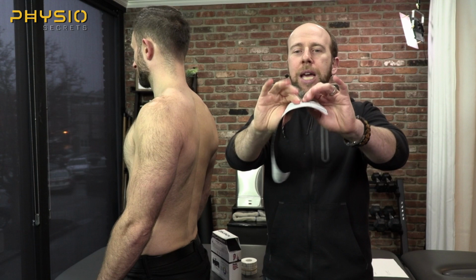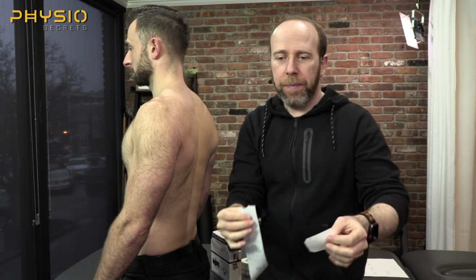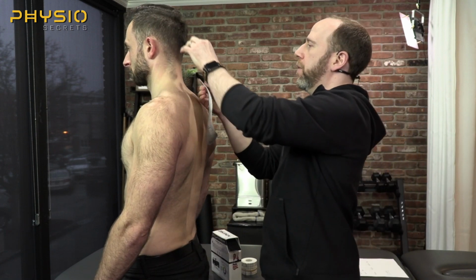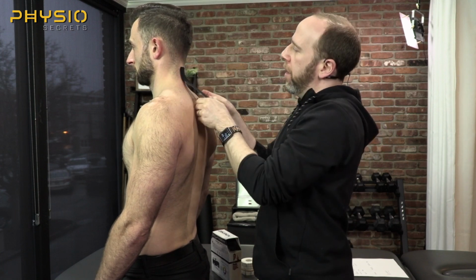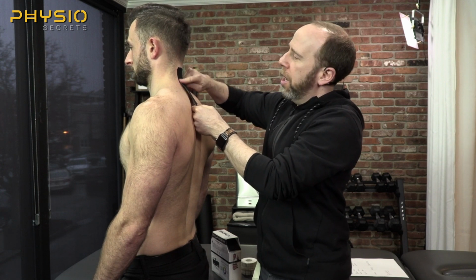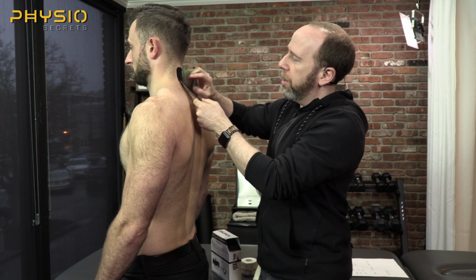So K-tape, you're going to break the tape with a decent size anchor. They say at least a 2-inch anchor. And I'm going to apply this. Look straight ahead for me. Just under his hairline here. Now, when I apply the anchor, there is absolutely no stretch to the tape, and there is no stretch to the skin. You want to apply the anchor with no tape stretch and no skin stretch. So that anchor is on pretty good.